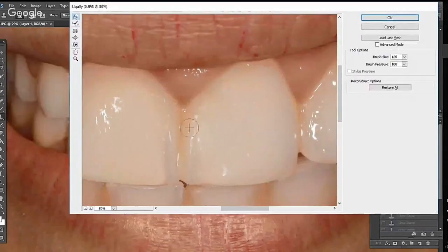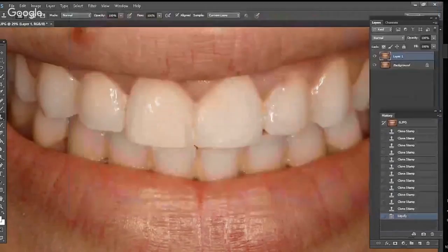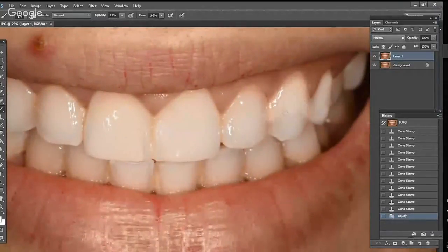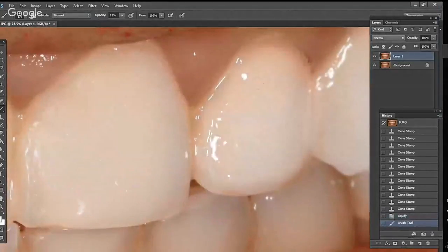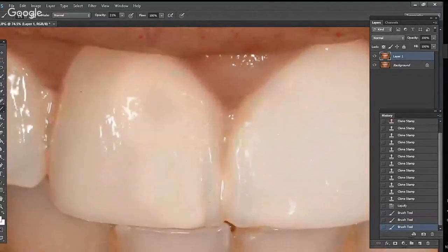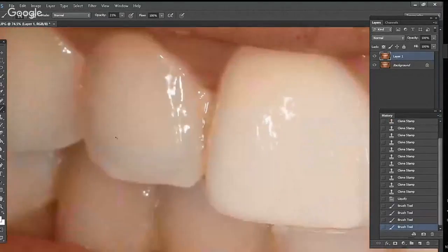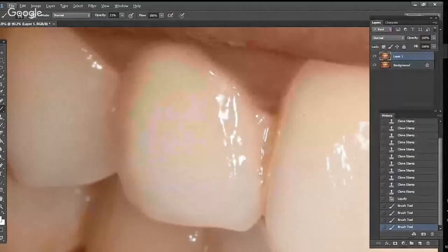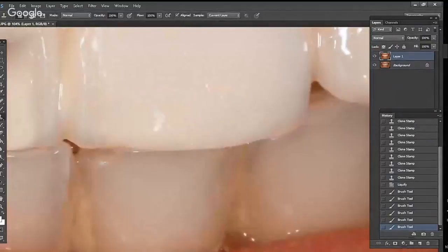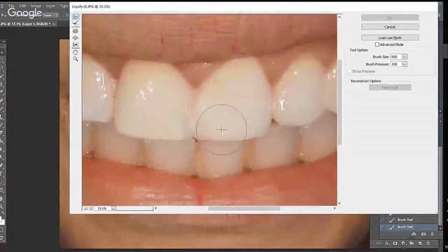We were also able to move transitional line angles. In this technique, you can simply hold a brush and paint the teeth if you want to simulate a bleaching treatment. This is not available in PowerPoint. And that's why I say that the software is really powerful.